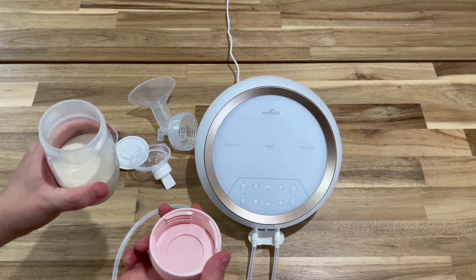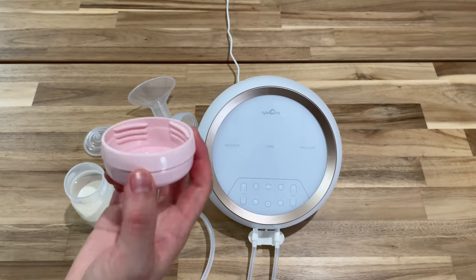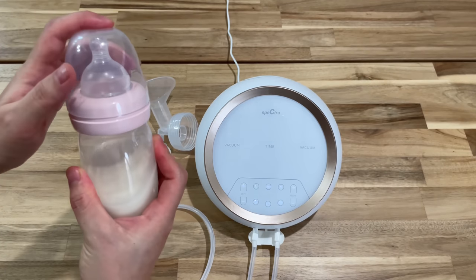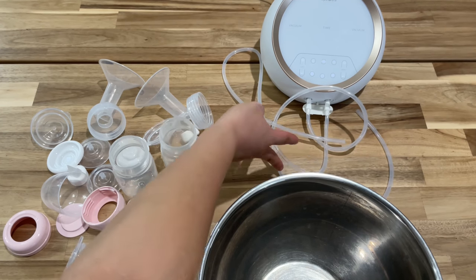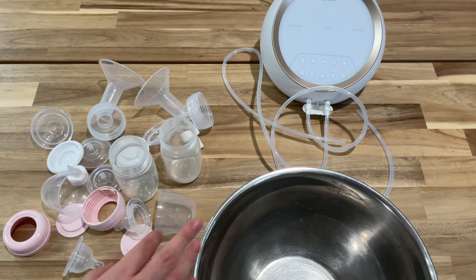This comes with a cap — you can close the bottle and store it in the fridge. If you want to use it right away for the baby to drink, you can use the same cap, attach the nipple, add the bottle protector, and give it to the baby to drink. After each pumping session, it is recommended to wash the parts that have been in contact with milk. The only things that don't need washing are the tubings, as they never come in contact with milk.